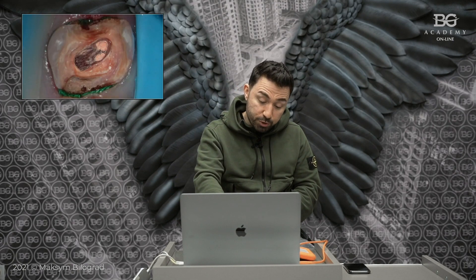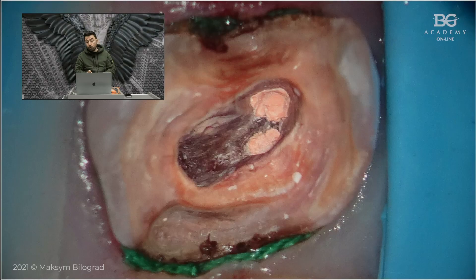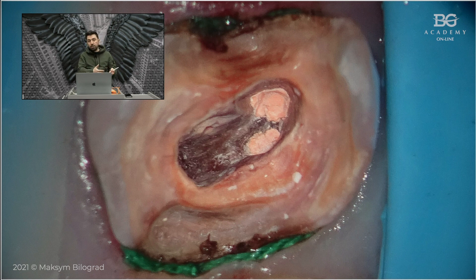A few tips about preparing the surface before bonding procedures. I personally prefer to use a sandblaster with aluminum oxide to clean the dentine and enamel, then proceed with normal adhesive protocol: etching, rinsing, drying, bonding, and then the core composite material. The problem is that if you use a sandblaster with aluminum oxide and there is exposed gingiva, you will essentially barbecue it and cause bleeding. So you have to protect the gingiva — use liquid dam or any flowable composite around the tooth, light cure it, then sandblast. Remove the flowable composite or liquid dam before doing your core build-up, otherwise the build-up may bond to it and make preparation more difficult.